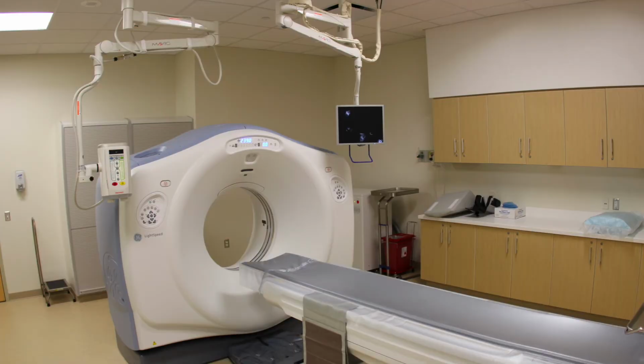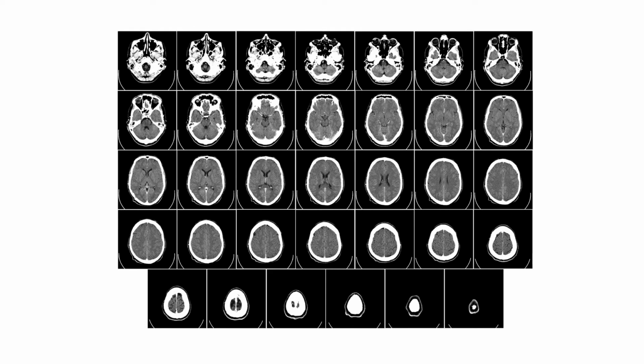This is a device most of you hopefully haven't seen yet. It's a computed tomography device designed to look inside patients' bodies. Using this device, we can produce high-quality images of patients' brains, allowing all kinds of medical diagnostics. Let's now have a look at how this machine works internally.